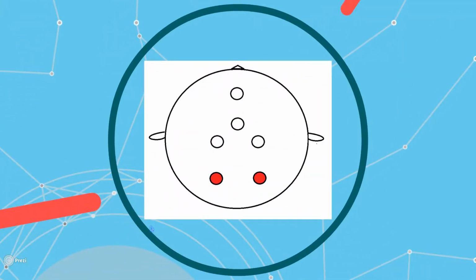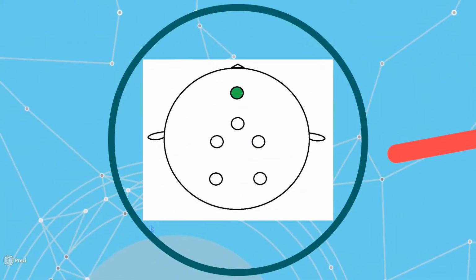Two more electrodes will be placed on the occipital lobe on non-hair-bearing regions, which will detect SSVEPs for two more targeted movements. Finally, one electrode will be placed on the frontal lobe where ocular artifact is the strongest.